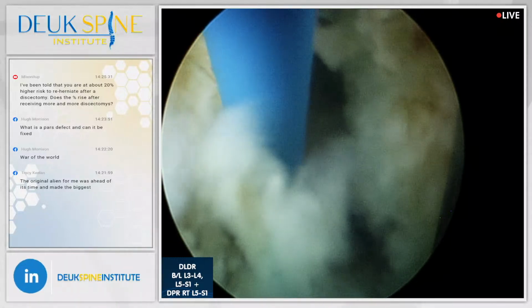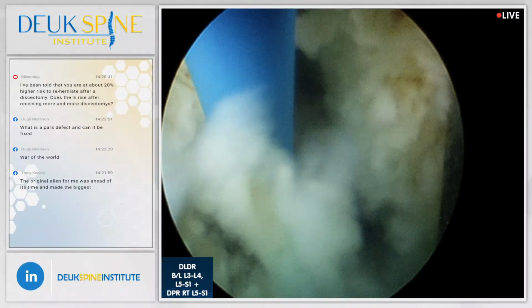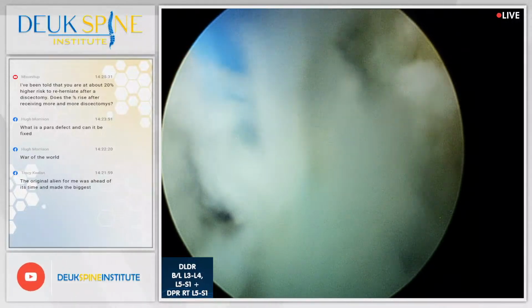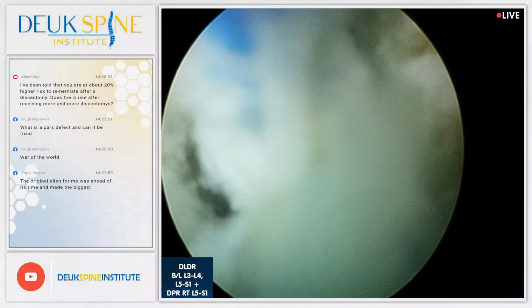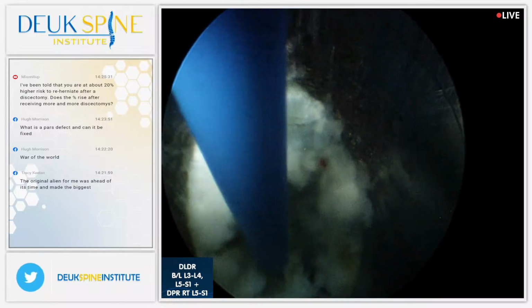And look at this right here. This is just dripping off here. So I need something here, like a towel on it or Raytec, just to keep it from coming out of the bag. Sorry, I'm dealing with a little drippage on my leg, kind of an issue.